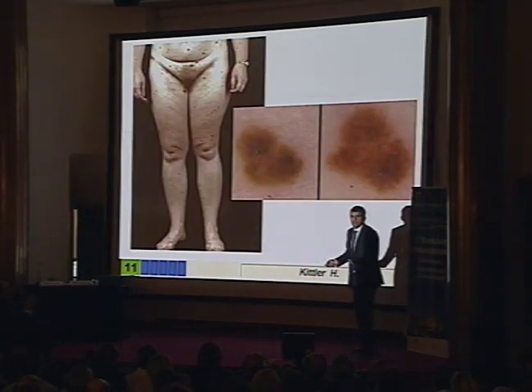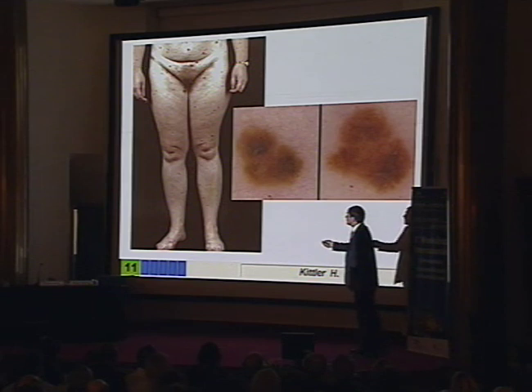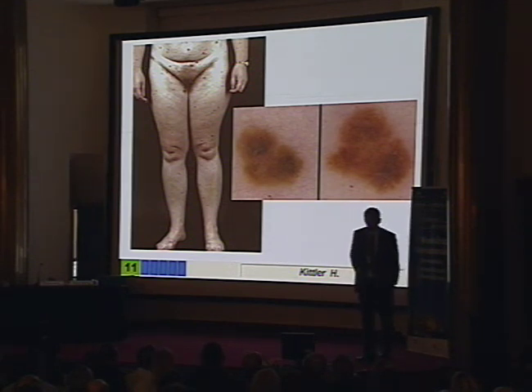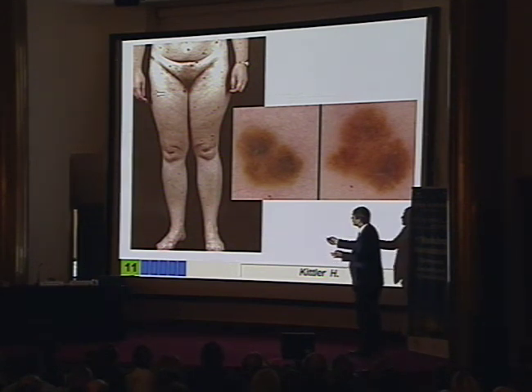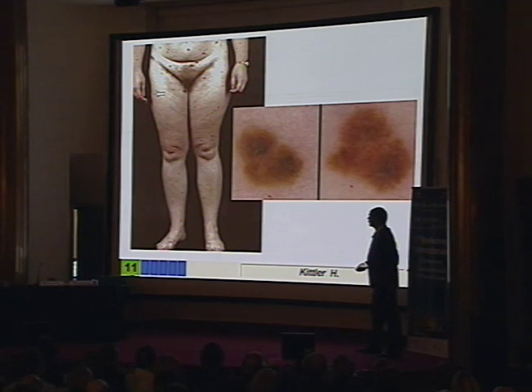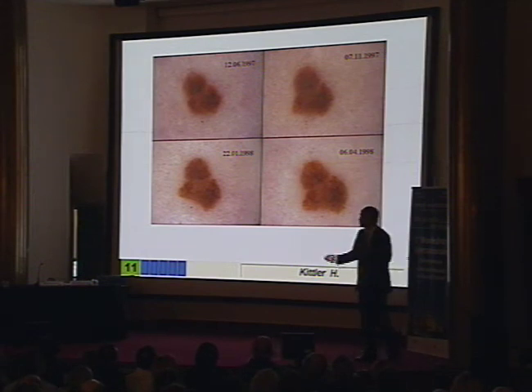This is a lady I know very well. She's the typical lady with multiple moles, an increased risk of melanoma. And here's the lesion. Increase in size, melanoma, very early. But this lesion has a history. This is the lesion here. And this was one of our first patients' follow-up. Here you can see the history of this lesion. And here you can see when we started monitoring.